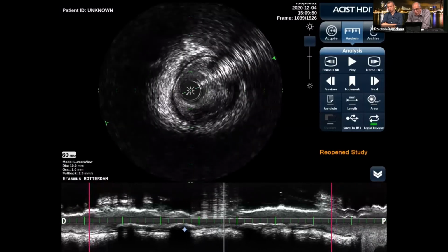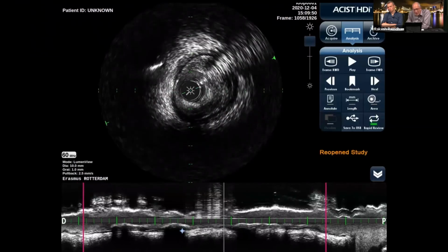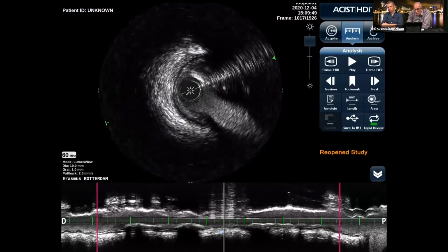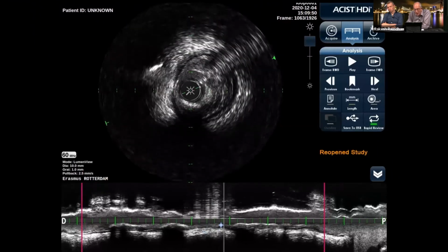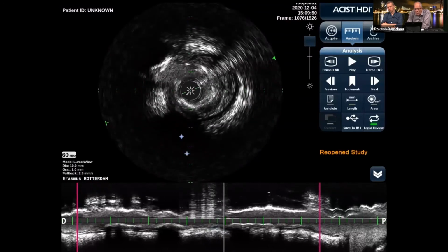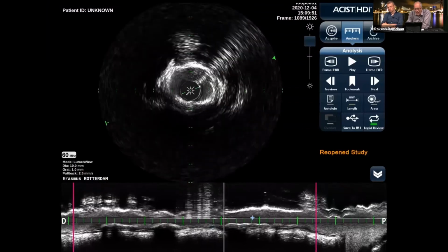And then we go to the proximal LAD, the part in here, what you see here, this is a diagonal branch. And then we saw also another branch, a septal branch in there. Well, how can you discriminate it? Well, in septal branches, it's very rare that you can find plaque, but diagonal branches have plaque, which has something to do with the shear stress and the angle from where diagonal branches emerge.